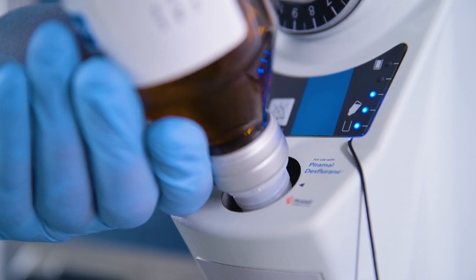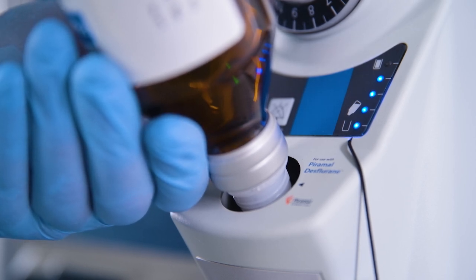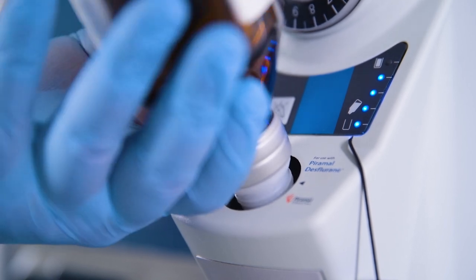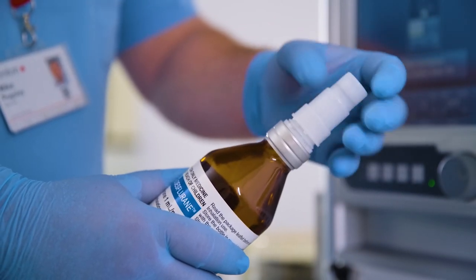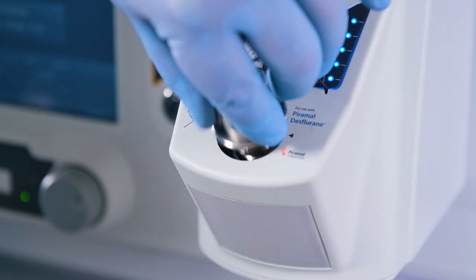Hold the bottle firmly in place. Liquid will flow into the vaporizer and the level indicators will illuminate as the level rises in the agent reservoir. When the agent reservoir full indicator illuminates, slowly turn the anesthetic agent bottle counter-clockwise. The spring in the filling adapter helps the valve in the bottle to close. The filling procedure is completed. Continue to slowly unscrew the bottle and withdraw it from the vaporizer filler port. A few drops of desflurane will remain in the filler port — this is normal. Refit the bottle cap and refit the vaporizer filler cap. Do not over-tighten.